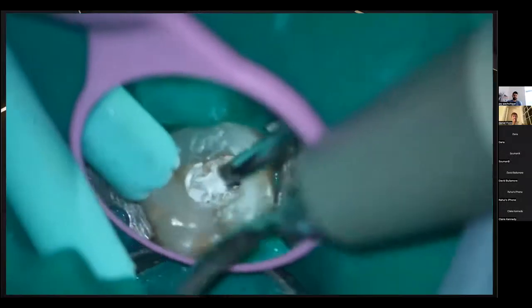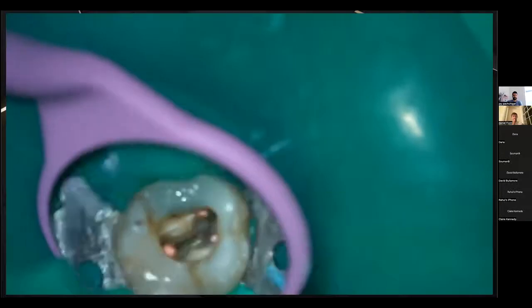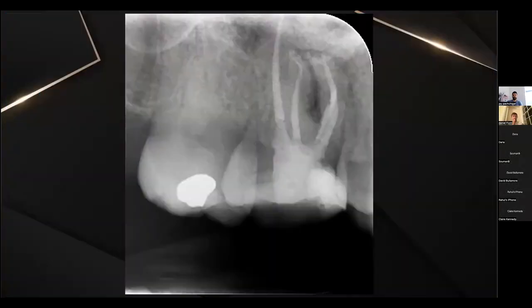Very easy, much easier than trying to get your plugger that deep into the canal. And again, just extremely easy to clean these teeth. So again, that's the post-op. Nothing remarkable here, but yeah, it's very easy. Now it does save a bit of time obturating the teeth this way compared to some of your other techniques.